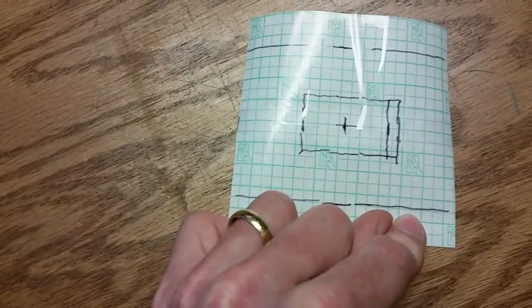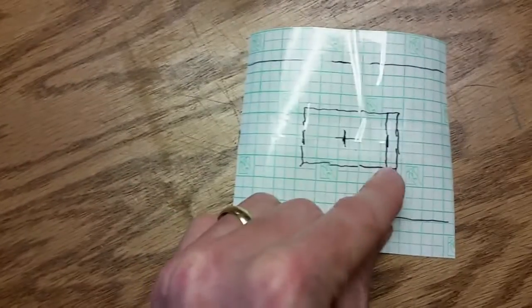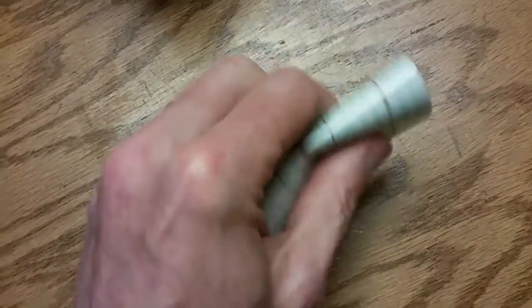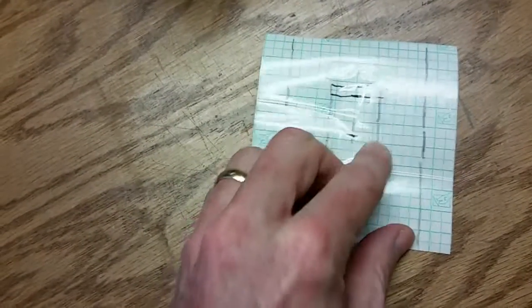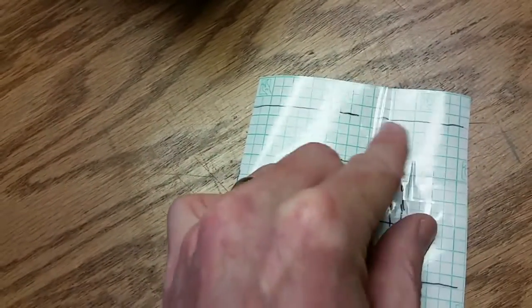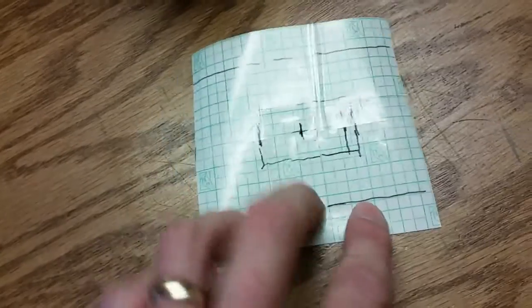Simply cut off this end, and then I usually fold the sheet this way to make sure the lines are lining up, and just cut one of these side pieces. And once you've cut the side piece, you can use the scissors to cut all around the inside of this piece, and the center piece will just fall out. Then I round these edges because rounded edges tend not to peel as easily. I'll show you what that looks like in just a second.